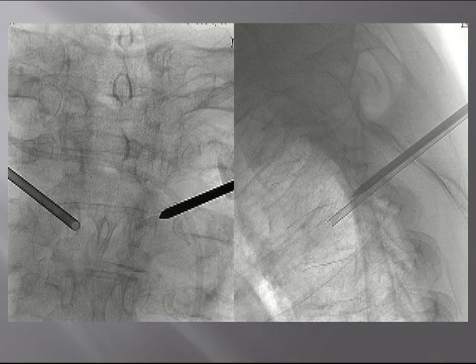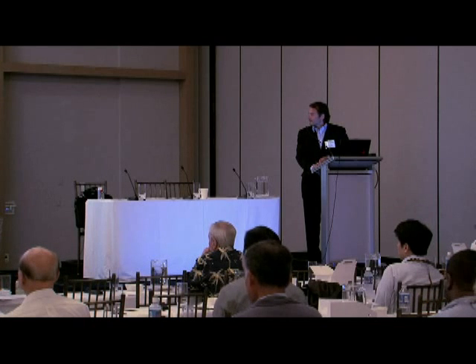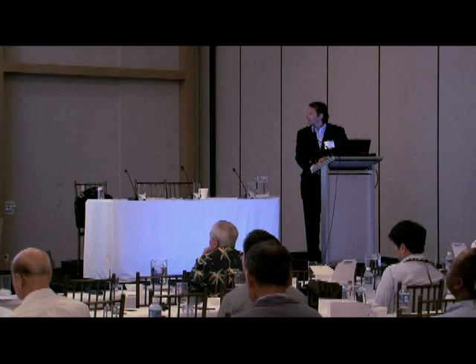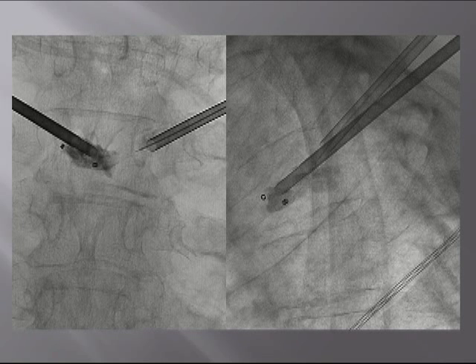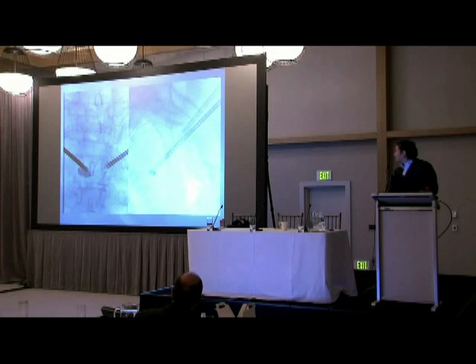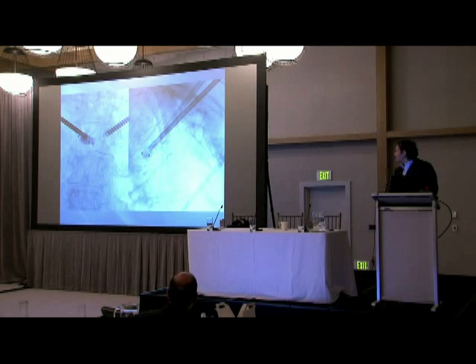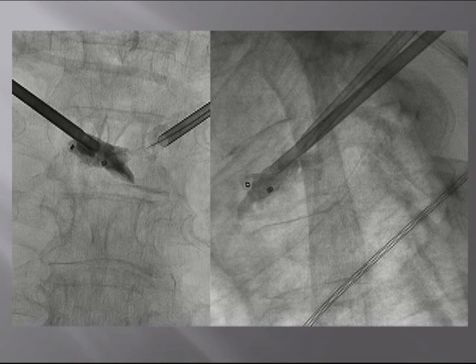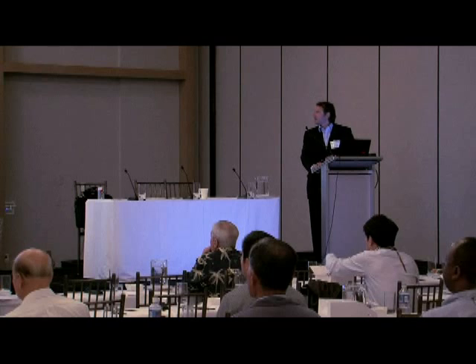So here we thought putting a balloon anteriorly and slightly inflating it would give better control than anything else to keep our high viscosity cement inside the vertebral body without leakage. So with a minimally inflated balloon and the cement very slowly over at least 25-30 minutes, the cement was delivered. And then after that, the contralateral side was used to put more cement into the vertebral body.